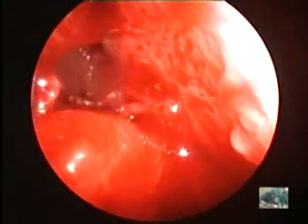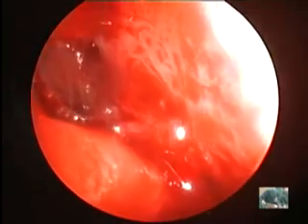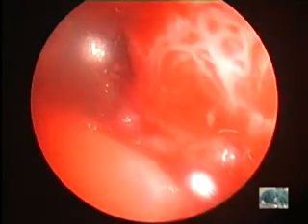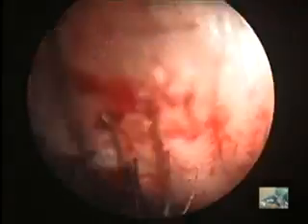So the next question is whether we still need to confirm it with the canine fossa approach. Now, I think if you've seen the maxillary sinus contents with the inferior meatal approach and you've got a good visualization of the natural ostium, I would think that it would be superfluous to do a canine fossa approach. Okay. So a final look at the inferior meatus.